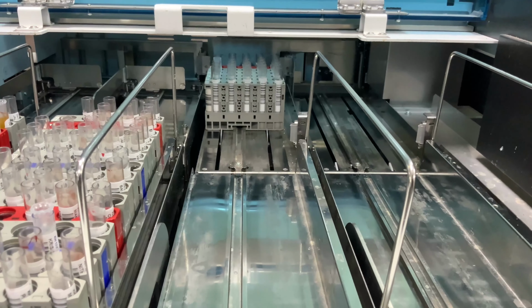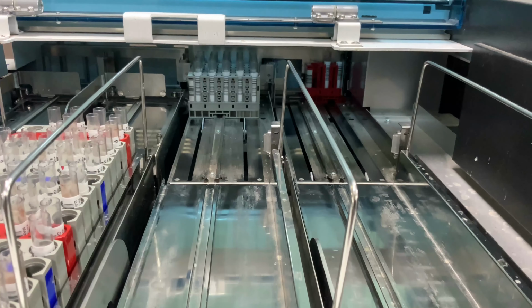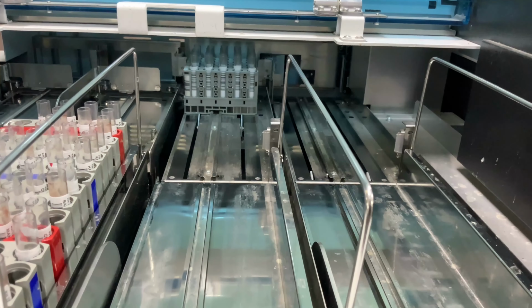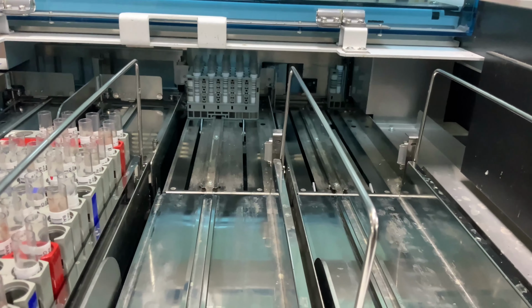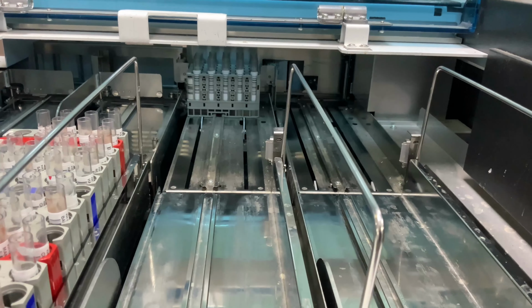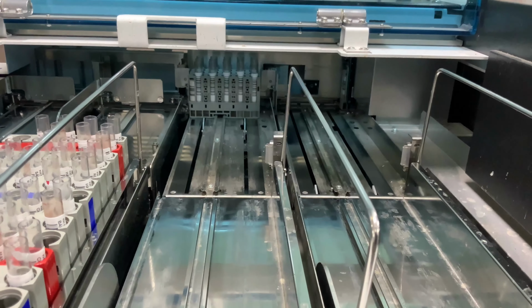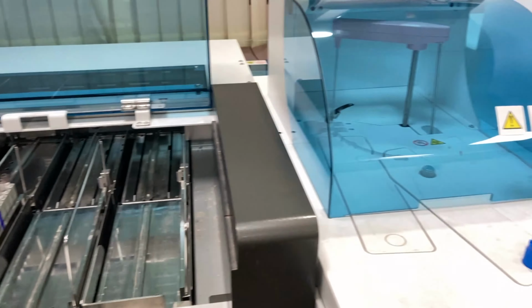The machine automatically takes in the samples and it scans the barcode of each sample, identifies what tests have been requested for that particular sample, and starts processing them. The reagents required for processing the samples are already placed inside the analyzer. It will pick up the required volumes of the reagent and sample and add it to a measuring cell. A reaction is performed and the result is generated automatically by the autoanalyzer.